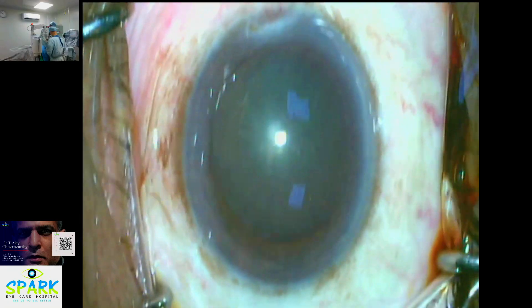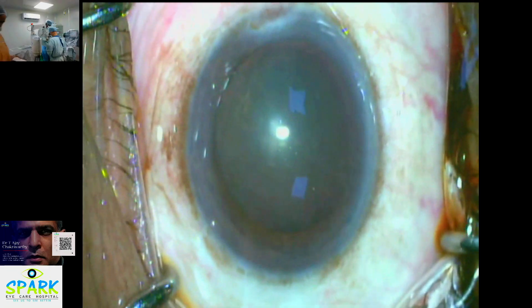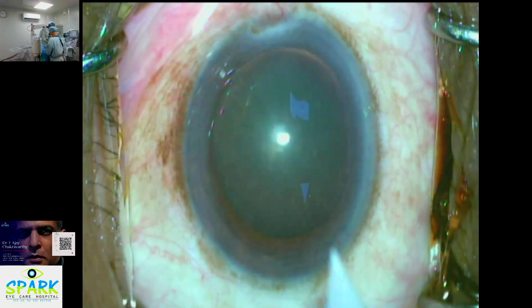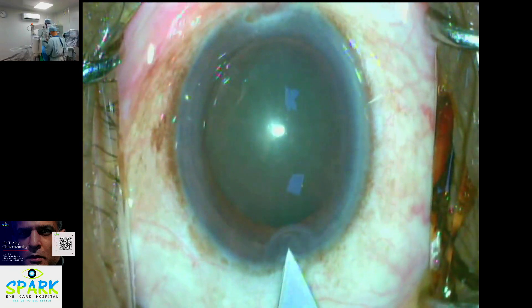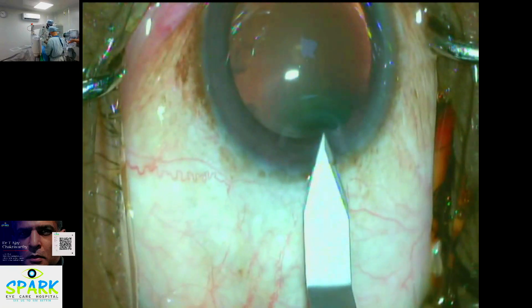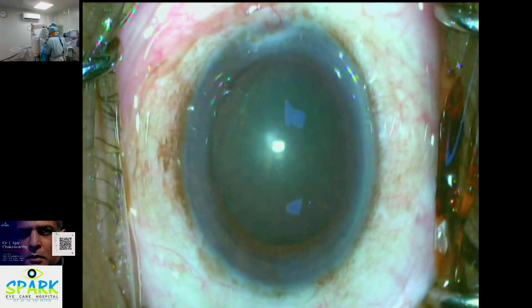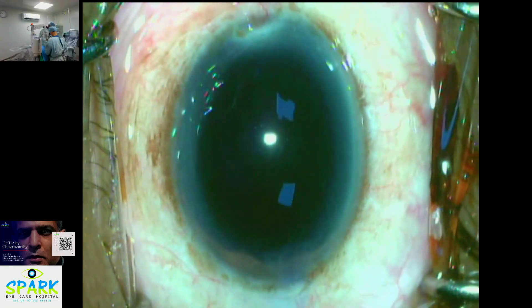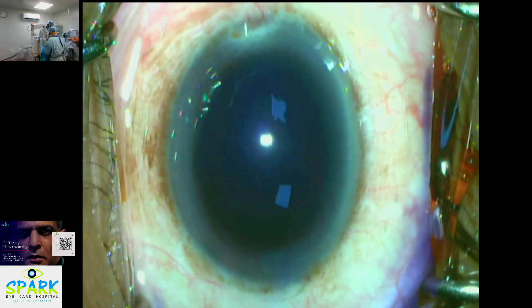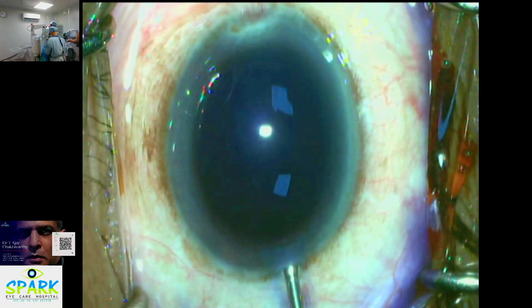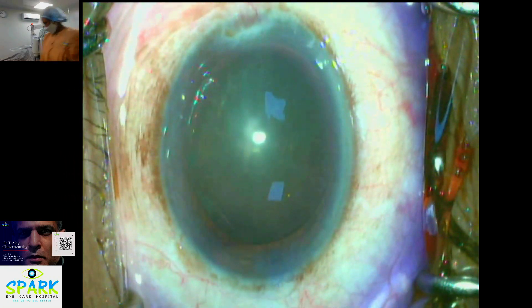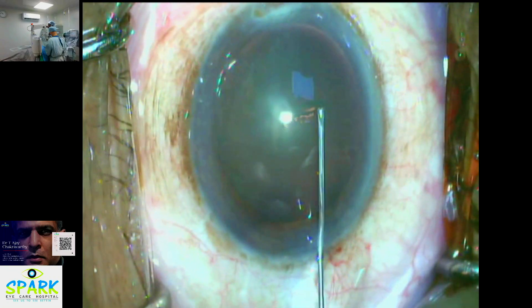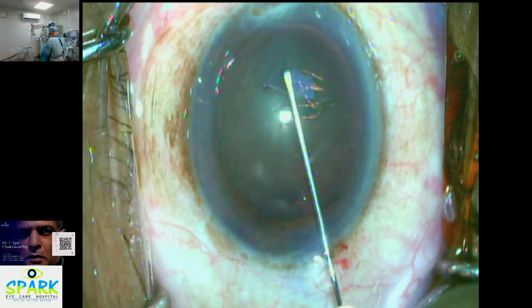This is a cataract surgery that we have done in the operation theater. We have done a simple cortical cataract.